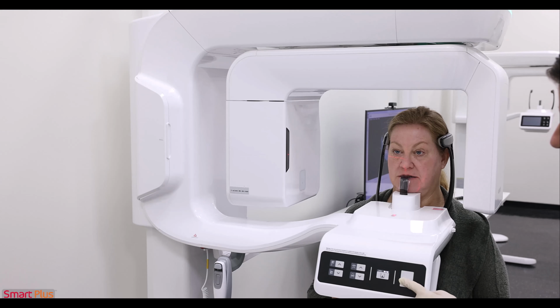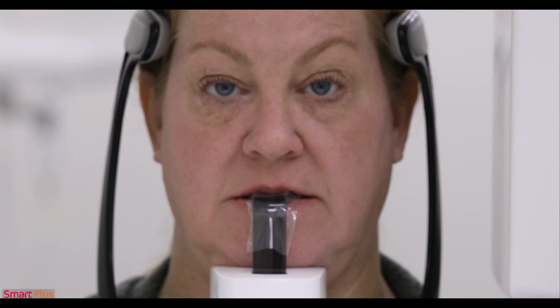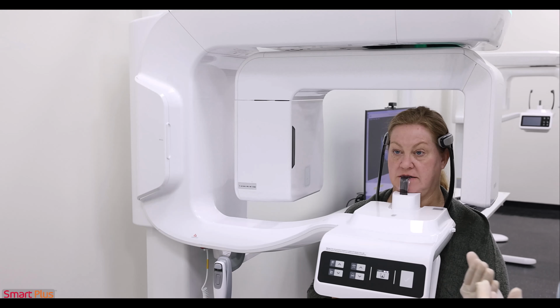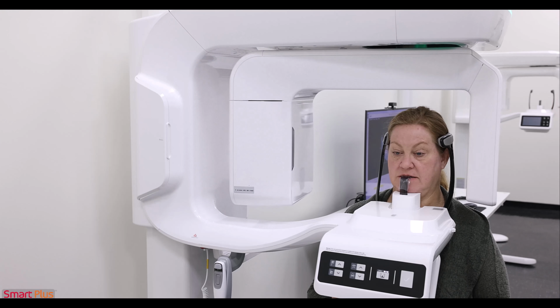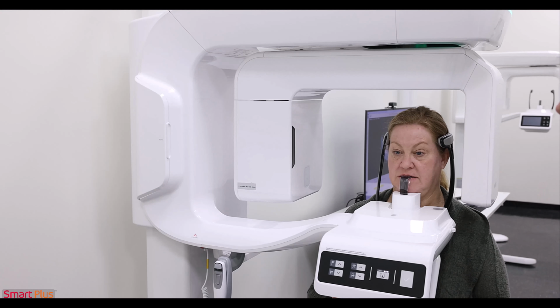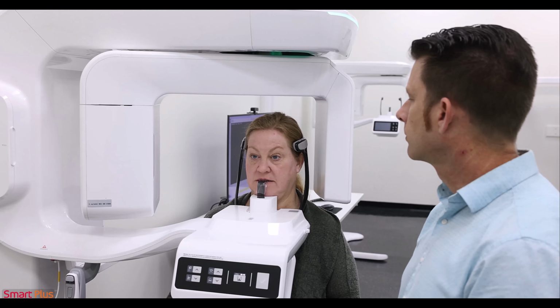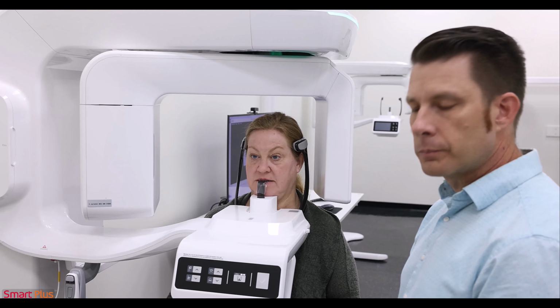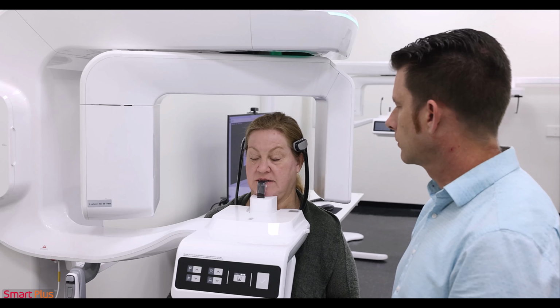I'm going to go ahead and click on the check mark or the ready button here. The system is moving into image capturing position. Please wait. The device does provide instructions again to have the patient close their eyes. In this case with the pan, I'm going to wait until it tells the patient to close her eyes, then I'm going to go capture the image. All right. The system is ready to capture an image. Please close your eyes until image capturing is complete.